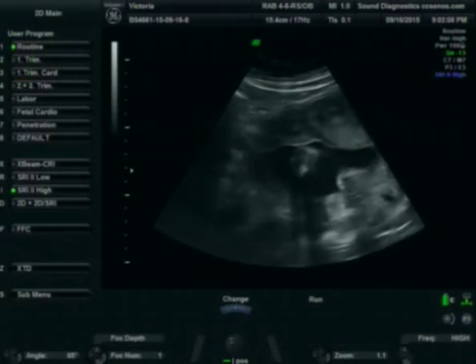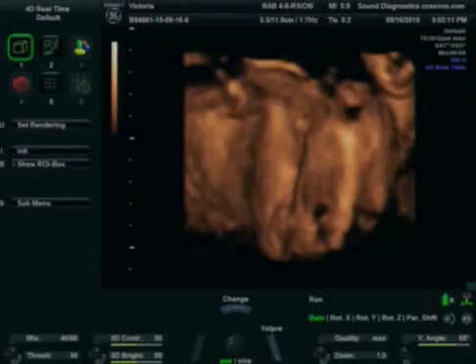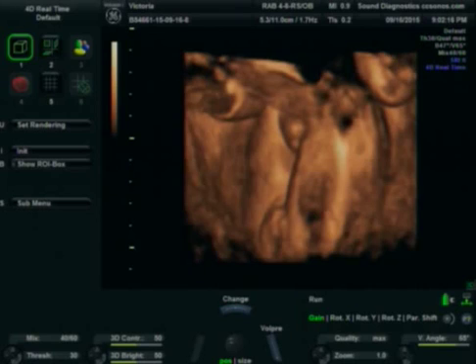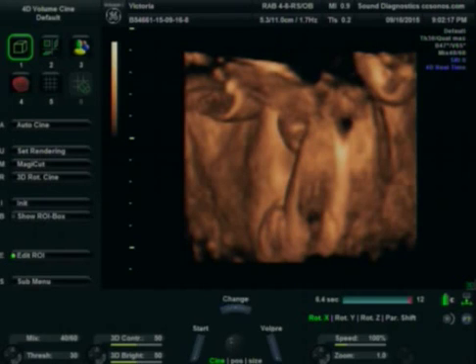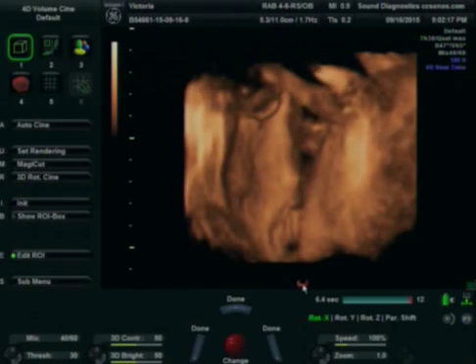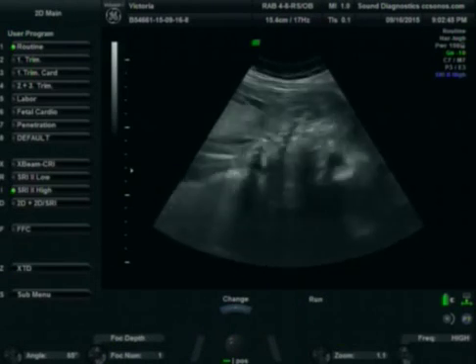So you see where the fluid is by the legs. Hey, we see that. Great. It's the face that's kind of smushed against the side. In fact, there's your baby's butt. At the bottom? Leg over here, leg over here. There's the private part right there. You're not being shy with that part. Not to be too graphic or anything, but I think it's a girl. I'm positive it's a girl. So all the fluid's around the butt, not so much around the face.